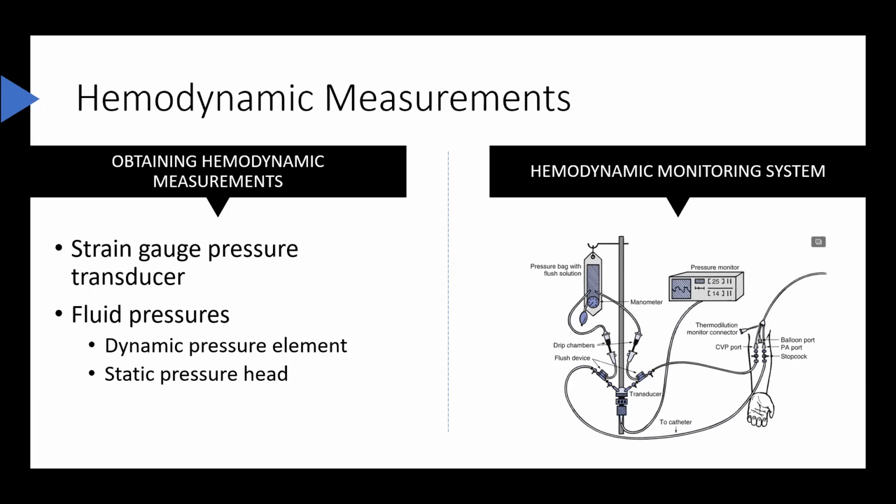Pressure transmitted to the fluid-filled dome portion of the transducer causes movement of the diaphragm, which alters the length of the wires of the Wheatstone bridge. Changes in the length of the wires result in changes in resistance to the current flow through the Wheatstone bridge. Thus, the pressure changes are directly proportional to the change in current flow through the circuit and inversely proportional to the resistance offered by the circuit.